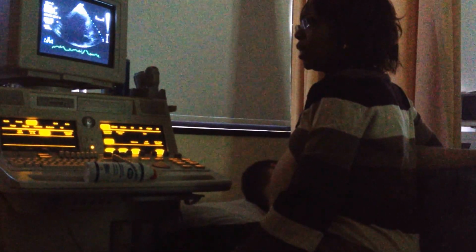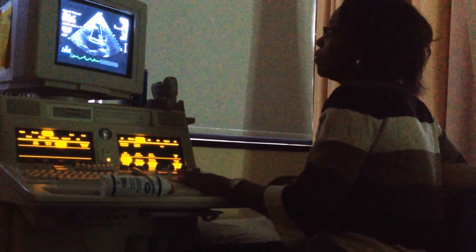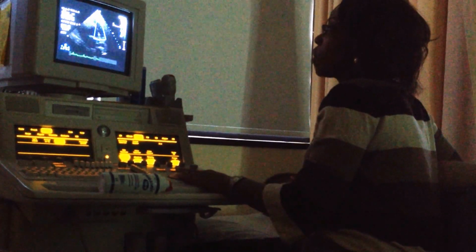Alright? I think I have you putting color on this for your PE. Real-time 2 beat loop and 1 frozen. Okay, maybe that's for your proficiency. So for your proficiency, you will be putting color on, and you just hit your color. And you can practice color on any valve, really, across any valve.